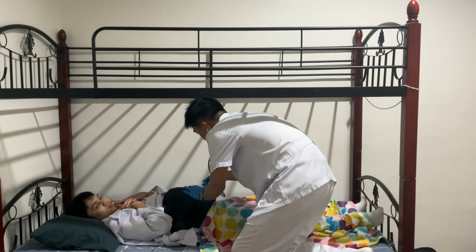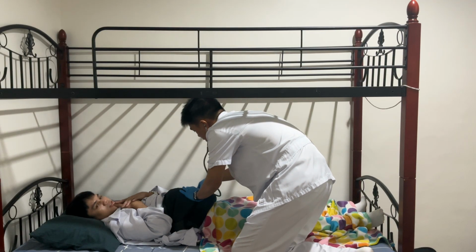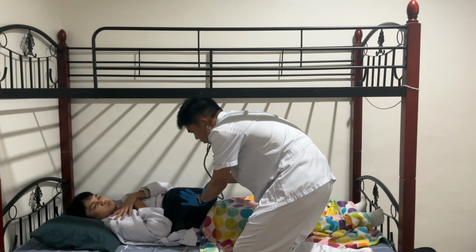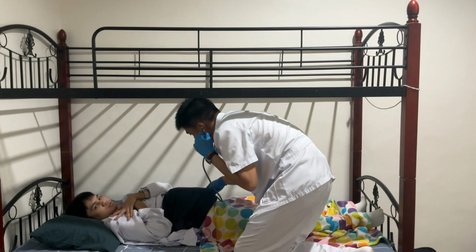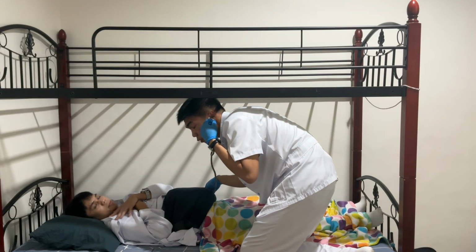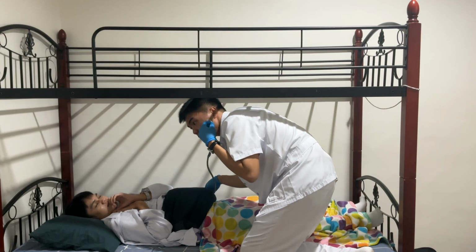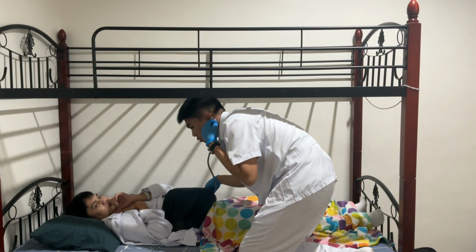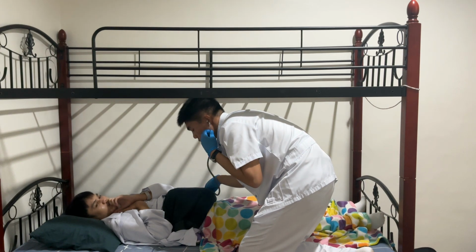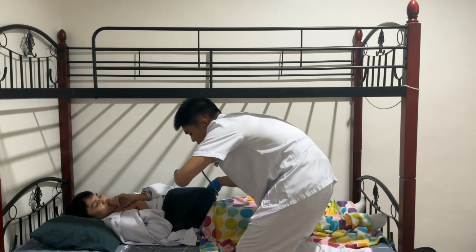I'm going to listen to it, finding from top to bottom, I mean middle to lowest part. So assuming that I have found the area, I'm just going to time for 1 minute, and I'm going to assess the rate, the character, and also if it is too quick or pounding, too strong, or too weak. So normal is 110 to 160. I'm just going to listen for 1 full minute since I've found it.